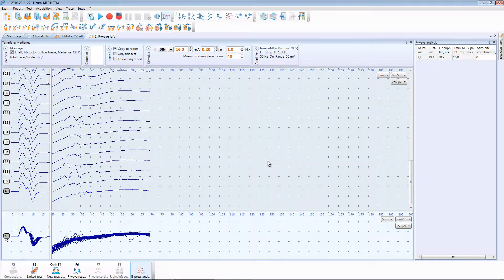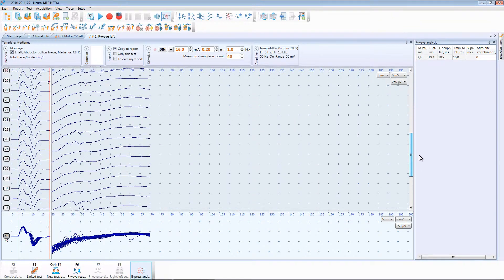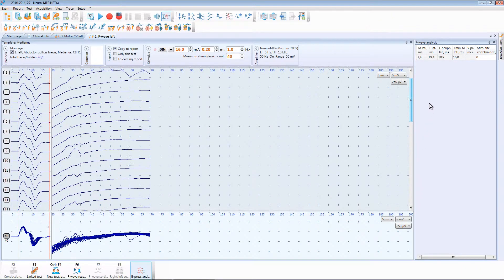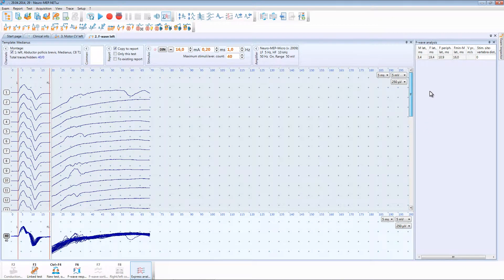After the acquisition you can observe all traces and make sure that all markers are placed correctly. If it is necessary you can adjust marker positions.